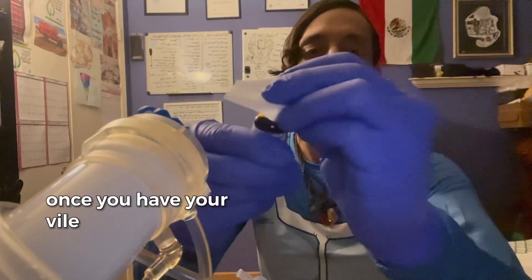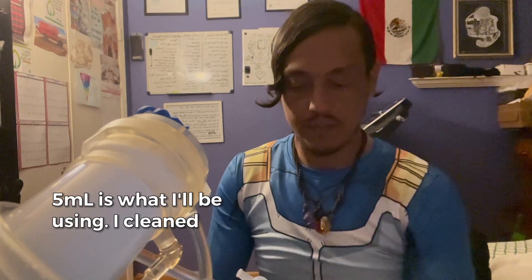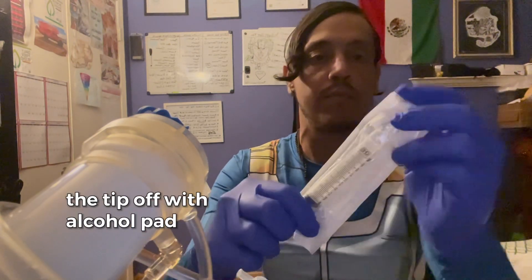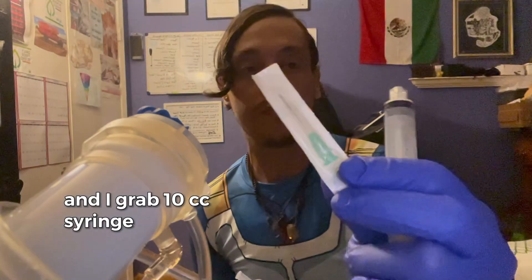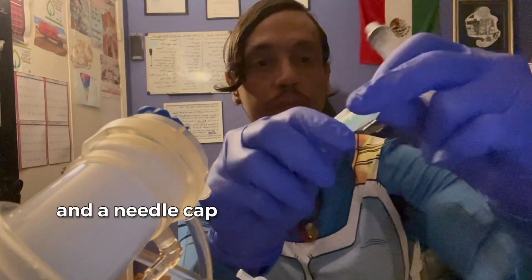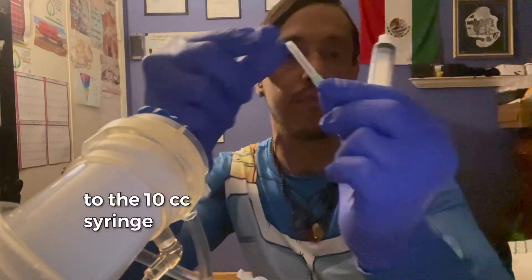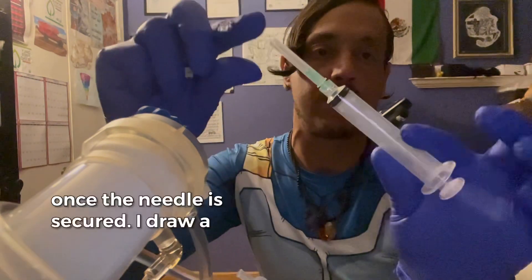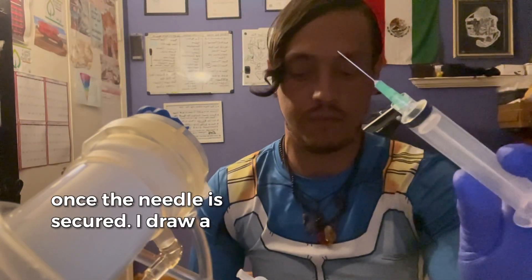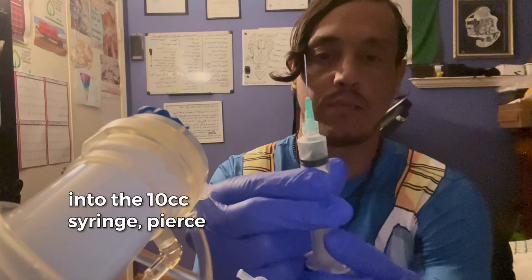Once you have your Venifer vial — 5ml is what I'll be using — clean the tip off with an alcohol pad. Then grab a 10cc syringe and a needle cap. Attach the needle to the 10cc syringe, and once the needle is secured, draw a bit of air into the syringe.